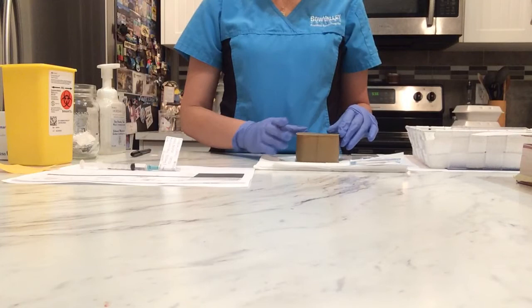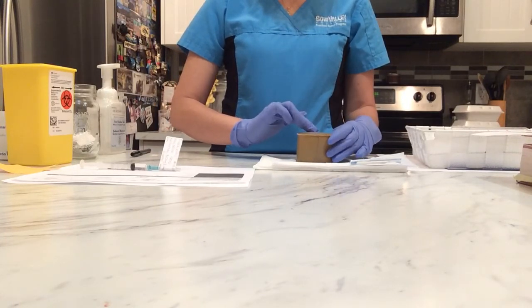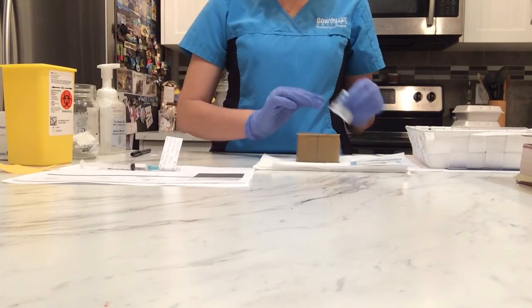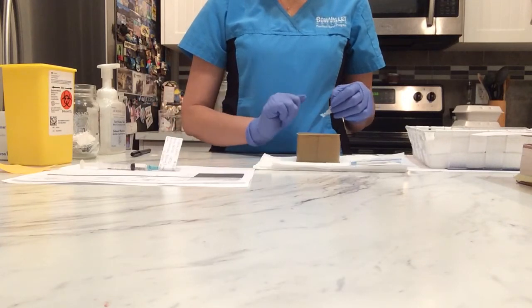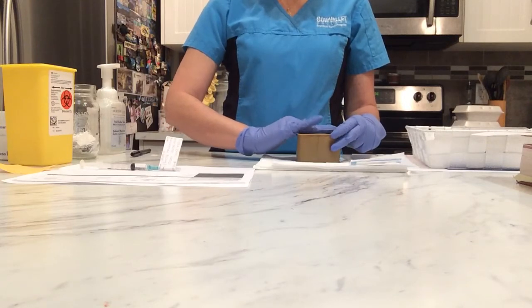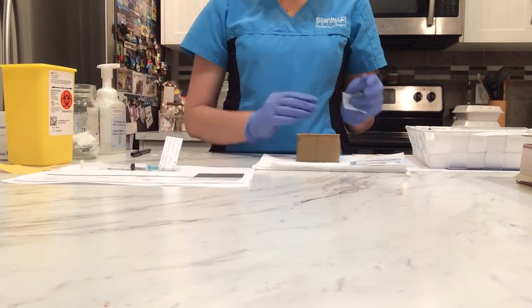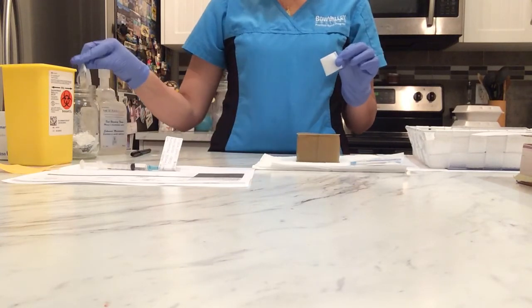I've chosen the site already. So I'm going to clean with an alcohol swab first. I can put my alcohol swab where I'm going to administer the injection. So as I said, 3 fingers down, and in the V shape I can inject my medication. Okay.